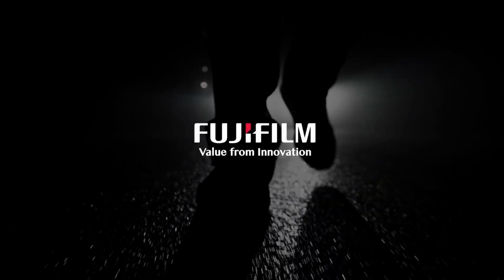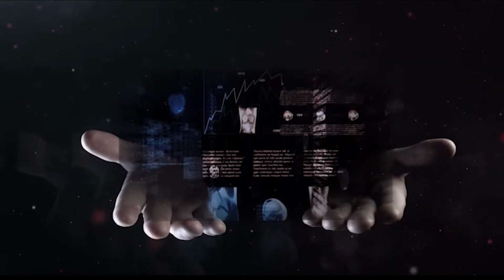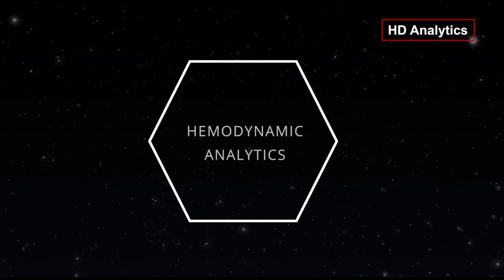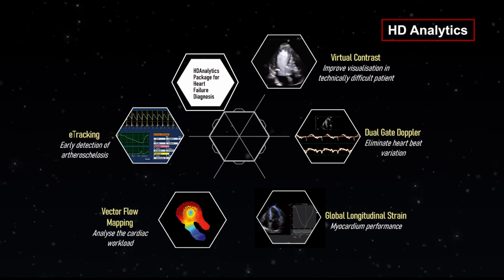With a globally aging population, the advancement in diagnosis and management of heart failure has become very important. Fujifilm is innovating healthcare by developing innovative ultrasound solutions. Introducing Hemodynamic Analytics, the unique solution that provides insightful clinical data beyond cardiac anatomy and function.